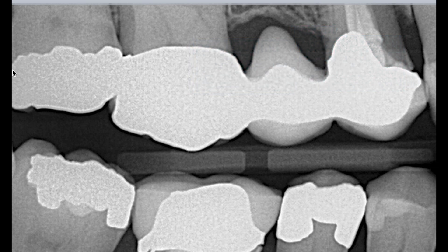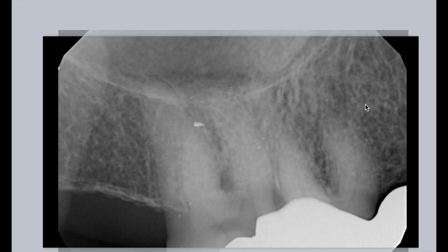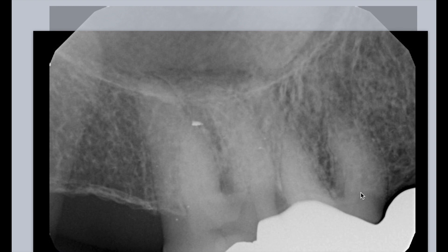This is the first tip in the Calcified Series. If you take a periapical radiograph, normally this is what you see — you can't see the canal. The patient comes in complaining of pain, can't sleep, whatever the case may be. You take this x-ray and think, oh my gosh, there's no pulp chamber. This is what I used to do — I'd be like, well, this is going to be fairly complicated.